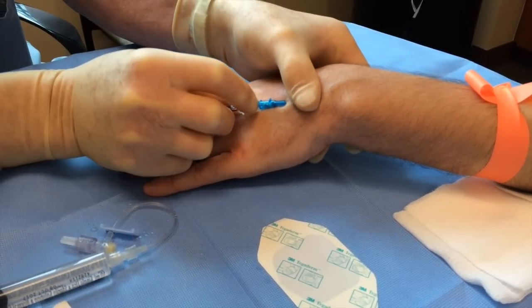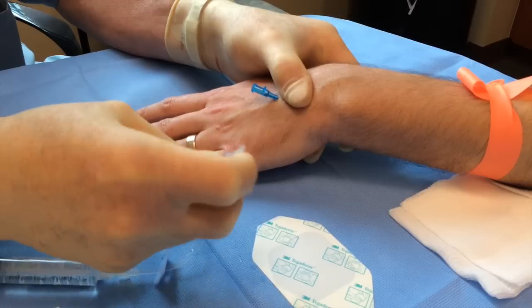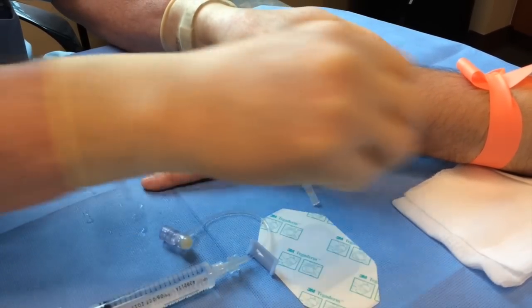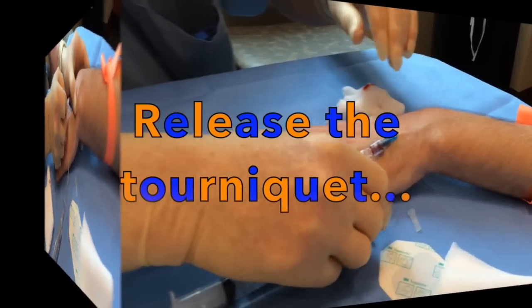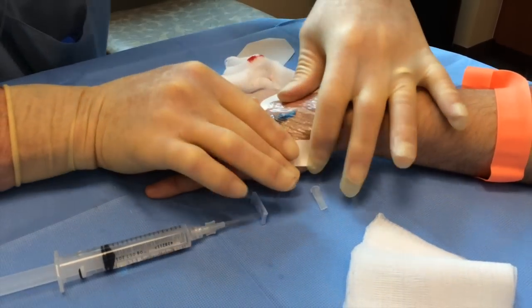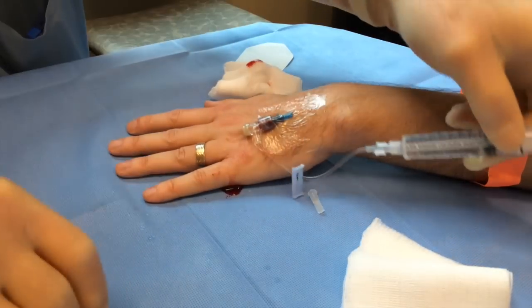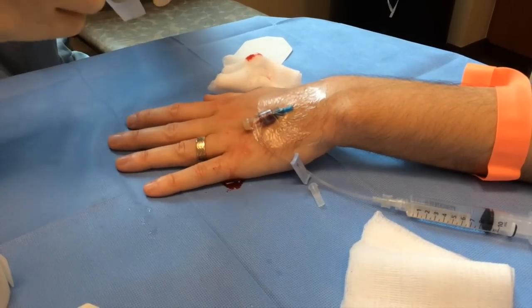Take your non-operative hand and put it over the tip of the IV. Then you take your connector and connect to the IV. Clean up your site and take your Tegaderm. Place it over your site, and you want it to be in line with the vein. Then use a piece of tape to secure it so that it won't catch and be pulled out — with a loop.